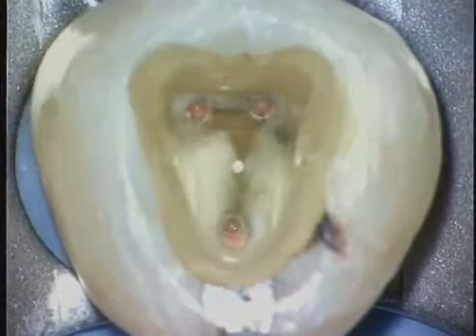The classic C-shaped molar then poses a lot of treatment challenges, and there's several distinguishing characteristics that we can notice. One, it's usually a mandibular molar. Two, it's usually a mandibular second molar. Three, radiographically it'll appear to have fused roots. And finally, there's a dominance or predominance for this tooth in the Asian population.